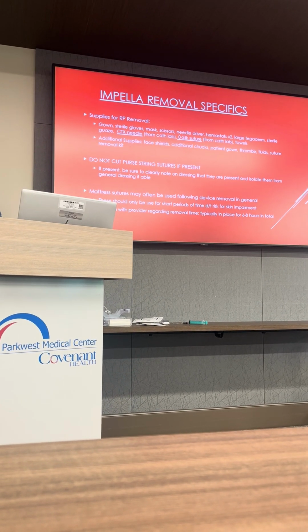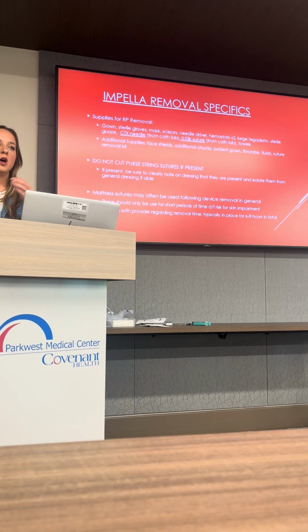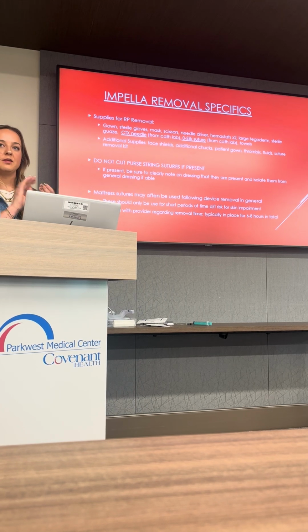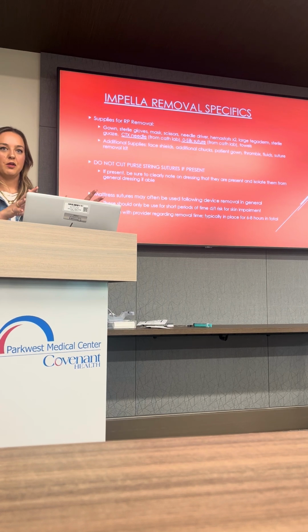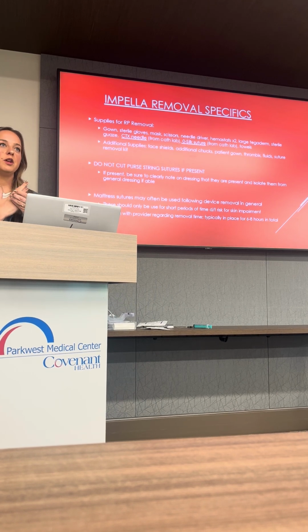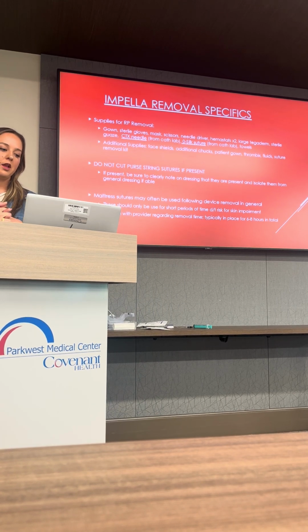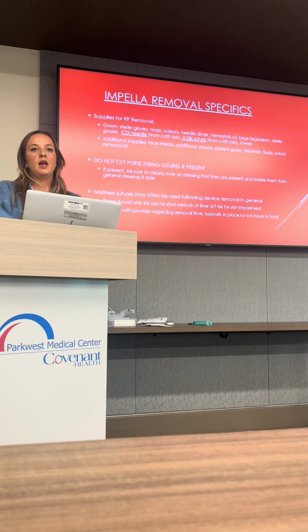Additionally, there's oftentimes where you'll see with these patients a small piece of gauze that's off to its own, typically dressed individually, and then around it may be the general dressing, but it'll have a big label on it that says purse strings, don't cut. A few years ago there was an incident where these got cut, and that wasn't necessarily ideal. I'm sure Dr. Negrato can touch on the importance of what these are, why they're used, and how beneficial they are.